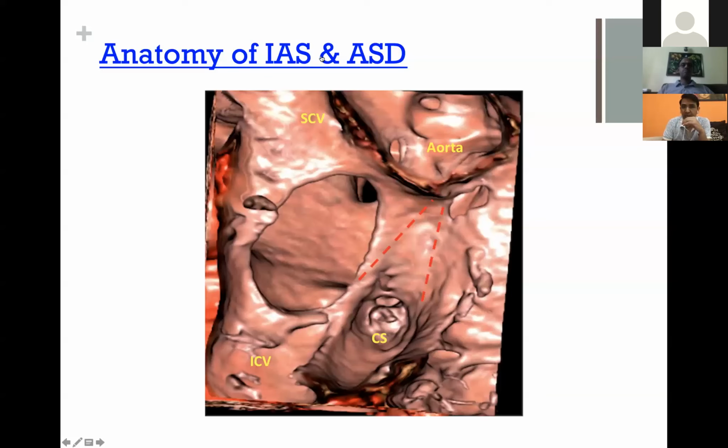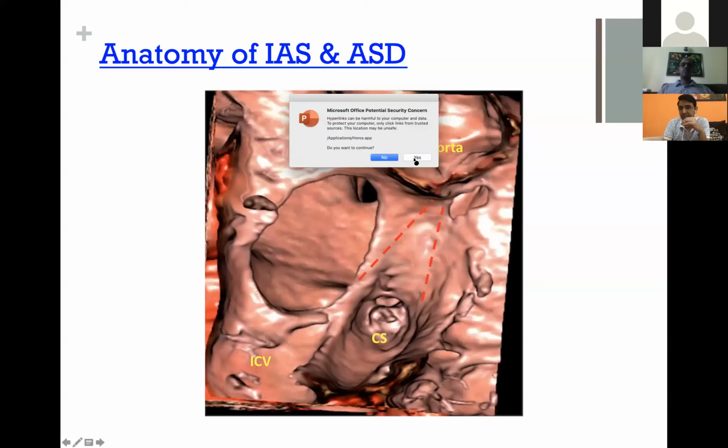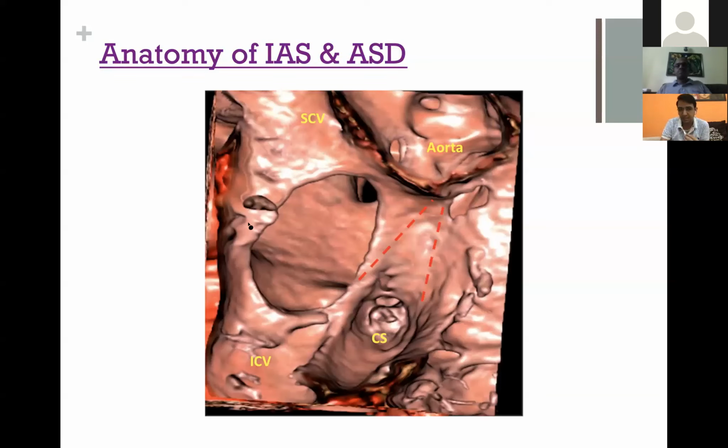Now, I just wanted to take 2-3 minutes to show one CT, how we see this. So this is one CT. I'm taking some liberty here, deviating from this, but I think it's important that we go ahead like this. This is one case, an adult patient with an ASD. As you would appreciate, there is right atrial enlargement, right ventricular enlargement, but the anatomy doesn't become as clear as we see in the 3D.